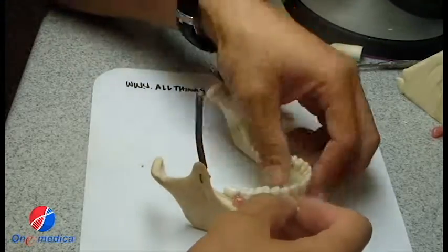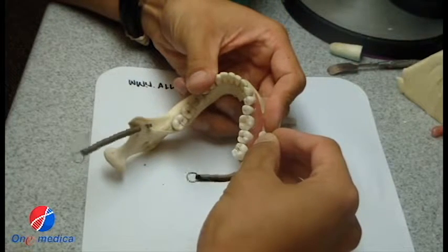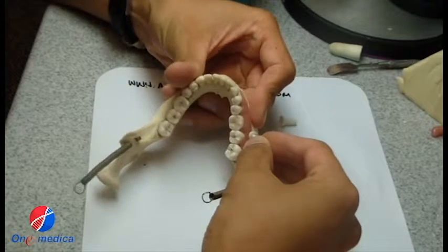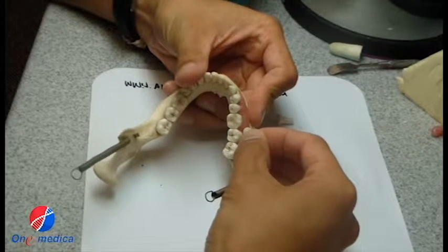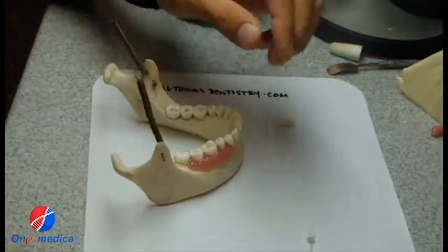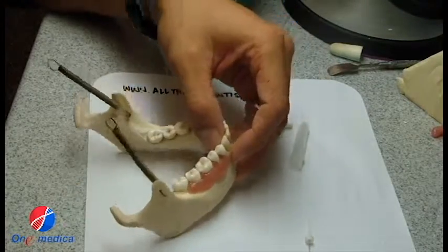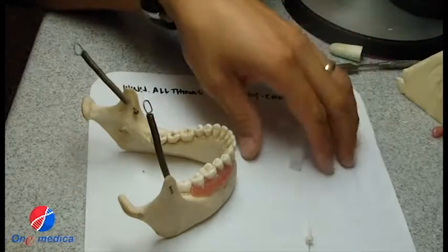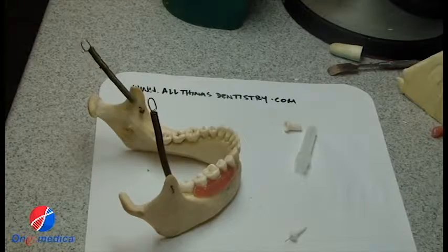And it's recommended, obviously, to look out for the roots. The technique that I've been using and seems to be approved is to put this on your slow speed, and this makes a little hole into the bone, and then you take your trusty old anesthetic syringe and try to find that hole. Now, that's pretty difficult, and let me just show you. I'm not using the right slow speed, I'm using the lab piece, but it'll suffice.